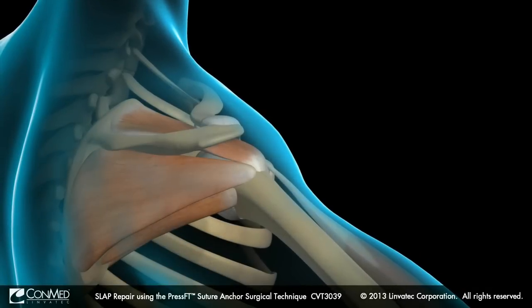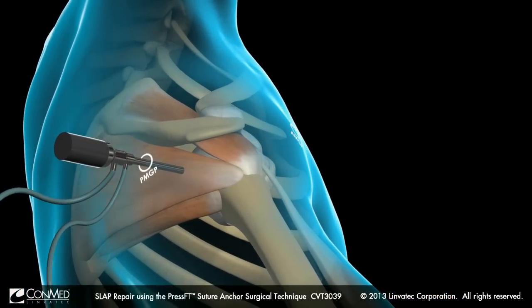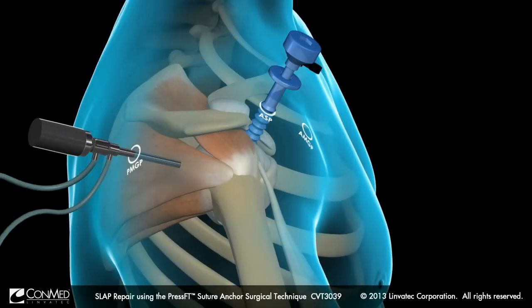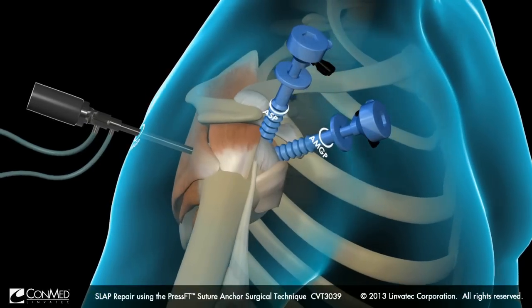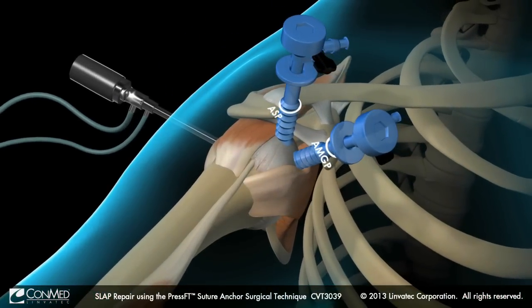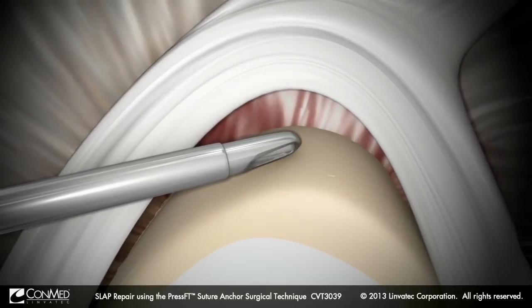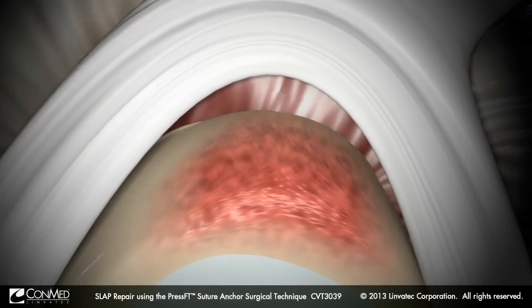The following SLAP repair will be viewed from the posterior mid-glenoid portal. An anterior superior portal and an anterior mid-glenoid portal are established using dry dock or hex flex cannulas. Prepare a healing surface for the labrum and biceps anchor by debriding the superior glenoid neck.